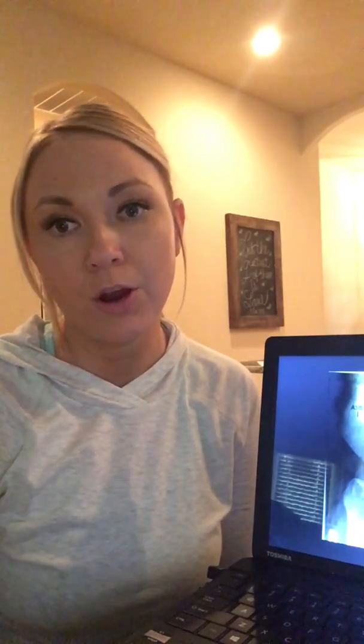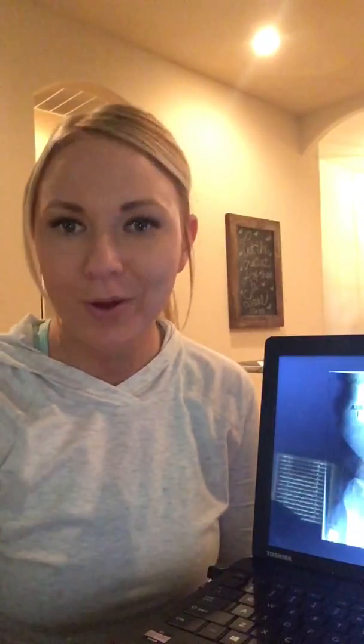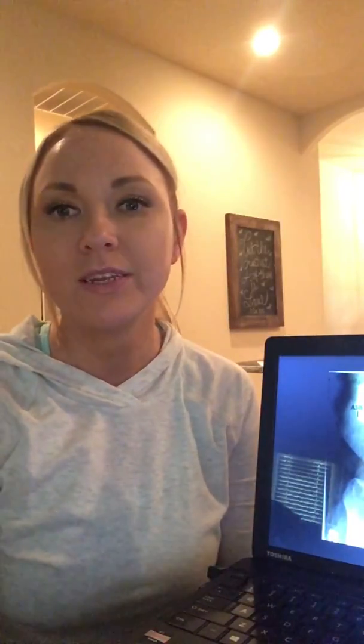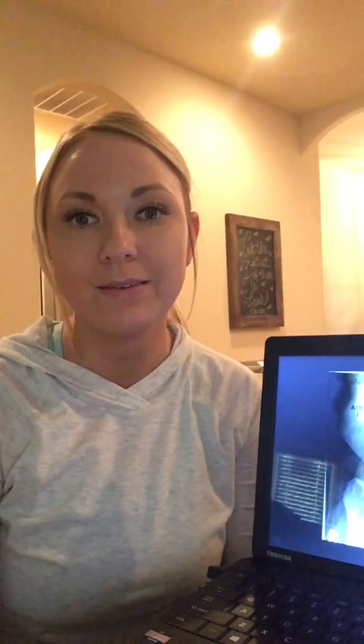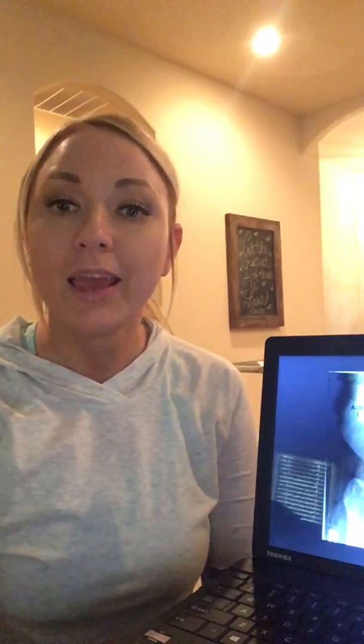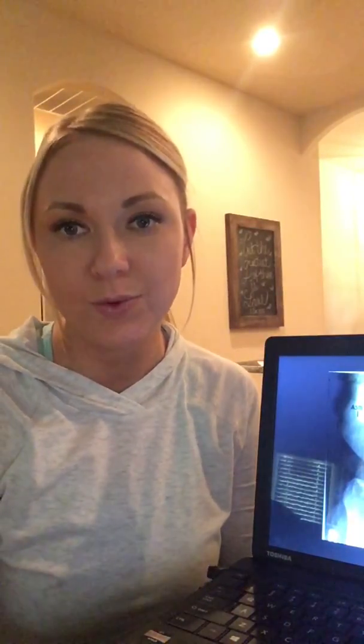So before I went and got the patient, I set up the room. I set the SID to 40, put the IR in the bucky in a landscape position. I got a gown ready for him, moved the tube head out of the way, and then I went ahead and got my patient. As I brought him in, I asked him his name and date of birth, verified that I had the right person. I pulled his study up on the computer and went ahead and set everything up. This was done on a Philips machine. The kVp and mAs were set at 80 and 25.